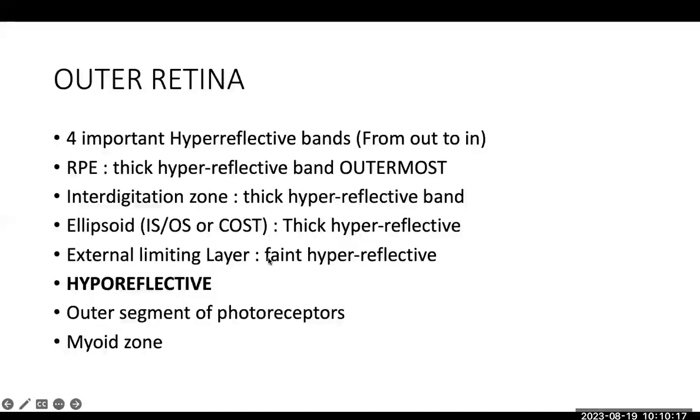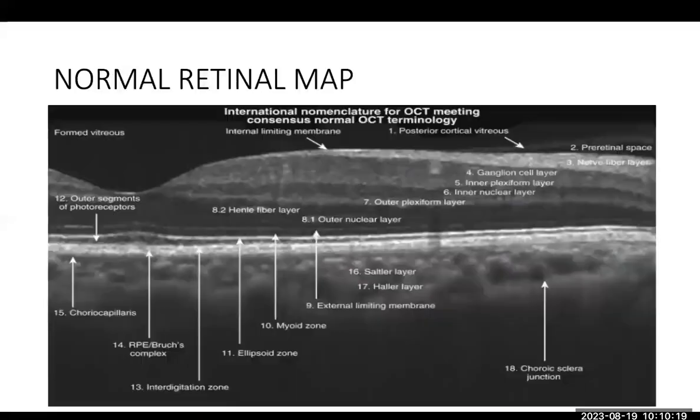If the slide is still on, there's a slide that has two eyes put together on the same map. I'll tell you the slide number. I think it's number 53. The two eyes are there so that the doctor will see. Slide 53.